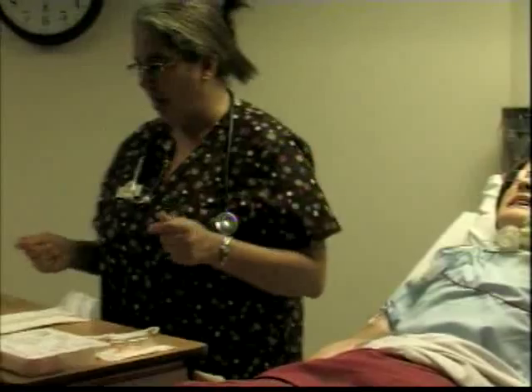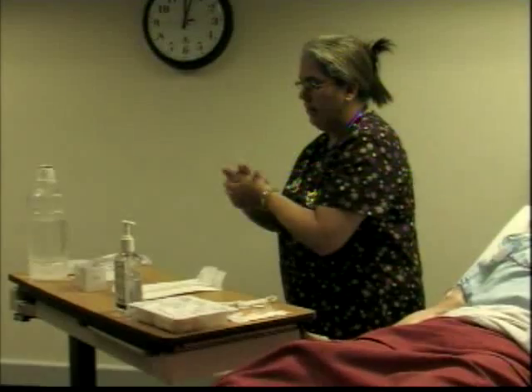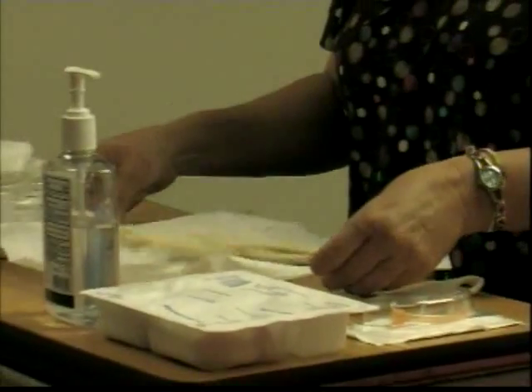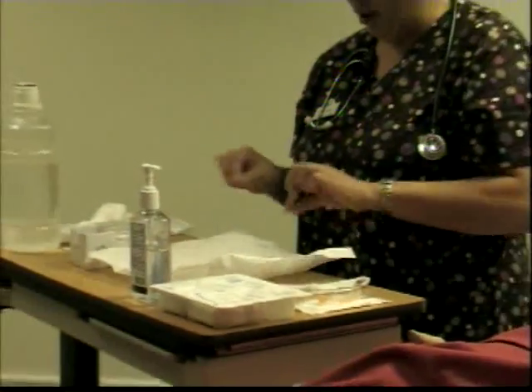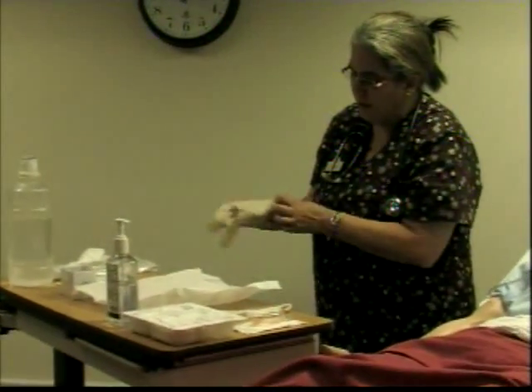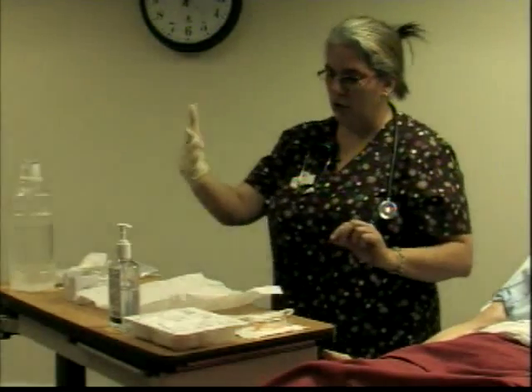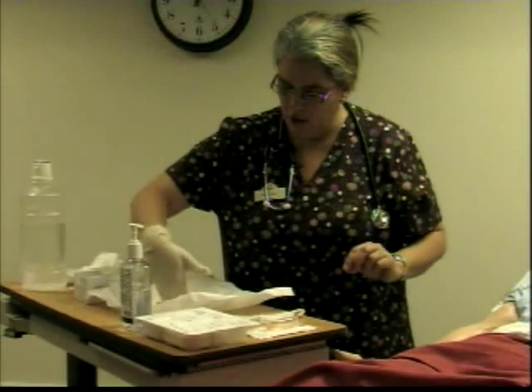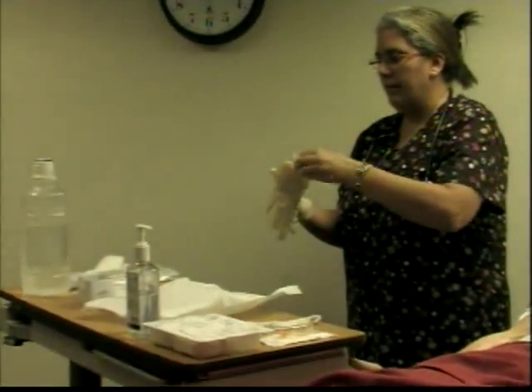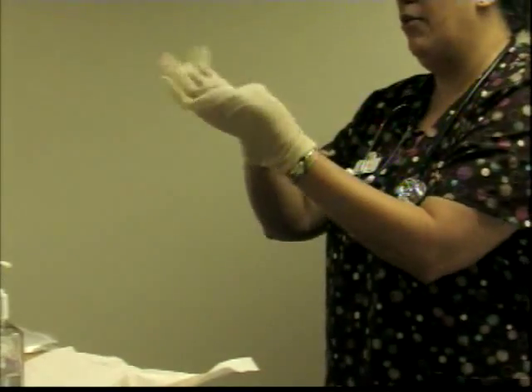Okay? So now we're going to wash our hands one more time before we start this. So you're going to open, and you have your gloves in there. Remember the 1-inch border and all the things you learned from 11:15. You put on your first pair of gloves. And remember that if it's twisted, you just wait until you get the one. This thumb hitchhikes under, come back out. Now you can fix it.